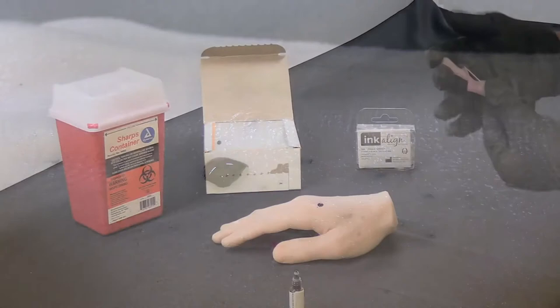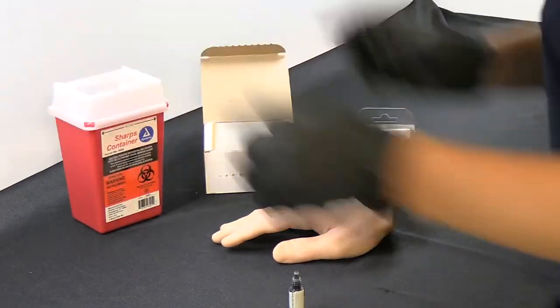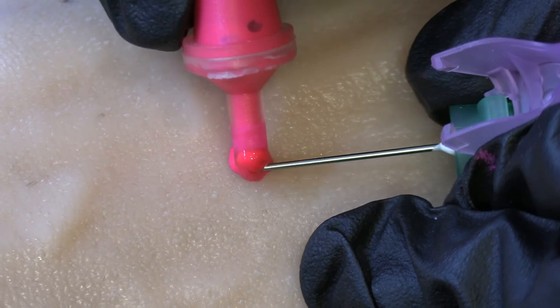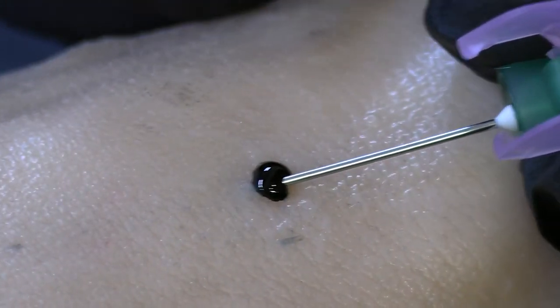Discard the needle in a sharps container. The Incoline can be disposed of in the normal trash. Clean the excess ink off the surface of the patient's skin. The same method can be applied for the UV pink ink single applicator and black ink single applicator.